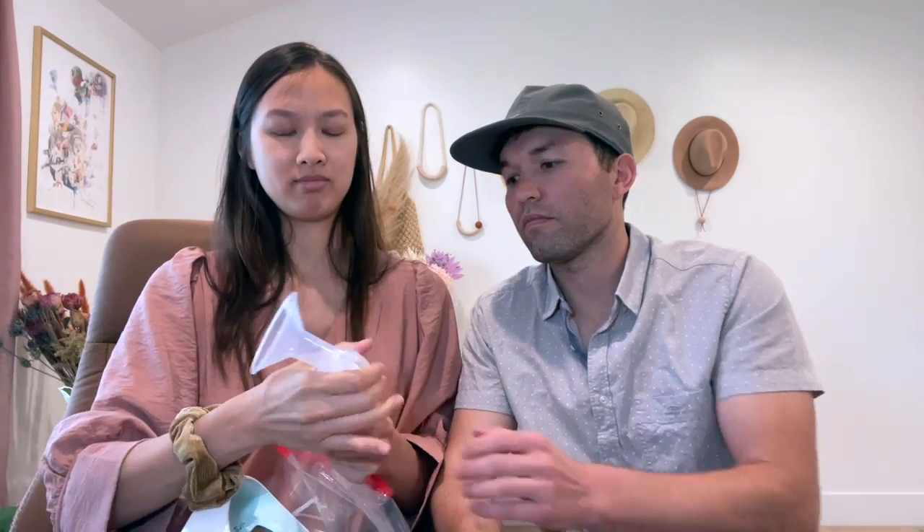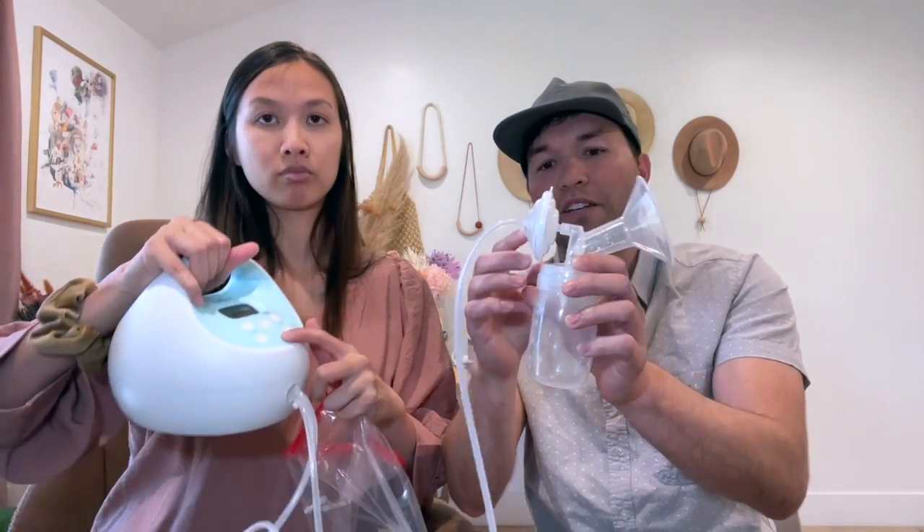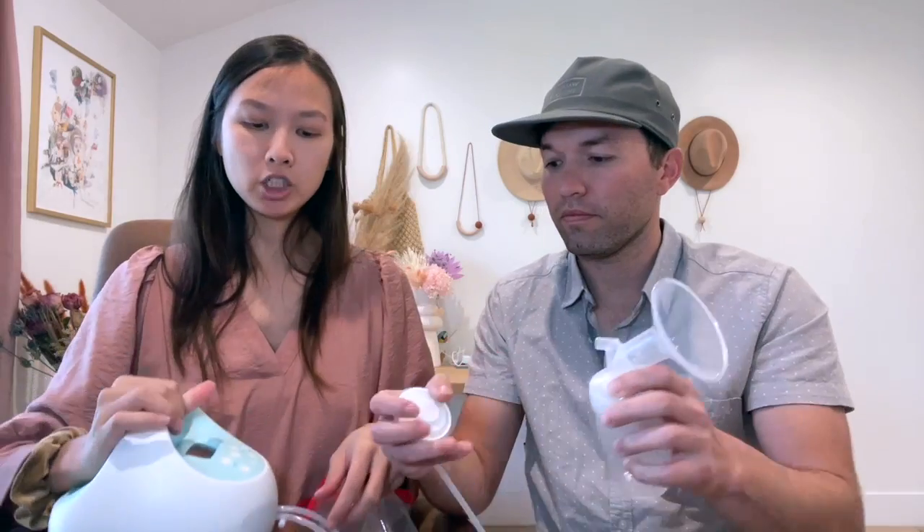They also sell replacement duck bill valves — funny name. All you have to do is put this here, and then it starts going in the vacuum. Pretty intuitive.